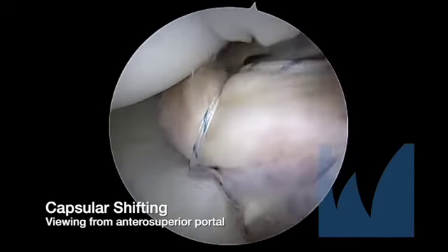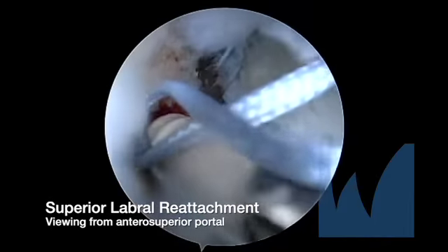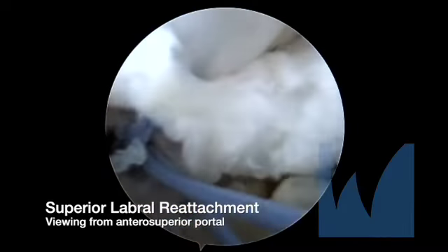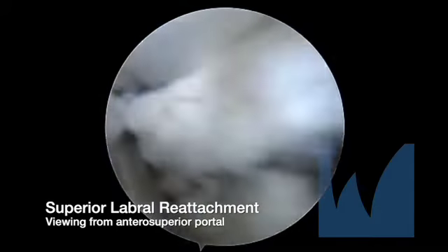A knotless anchor is used to reattach the traction suture to the superior glenoid. The amount of superior shift of the capsule can be measured from the shift from 3 o'clock. Finally, a mallet is used to secure the anchor into the bone, and a knot cutter is used to trim suture tails to 2 millimeters.